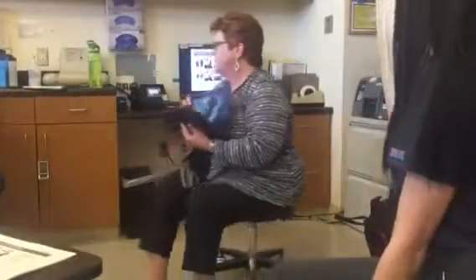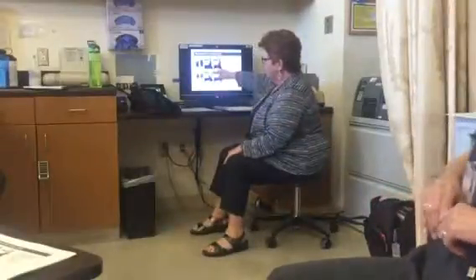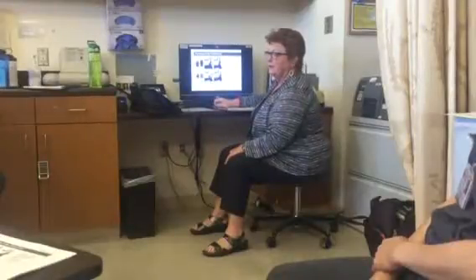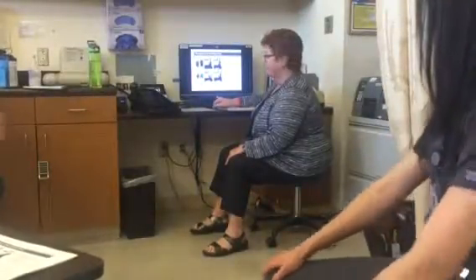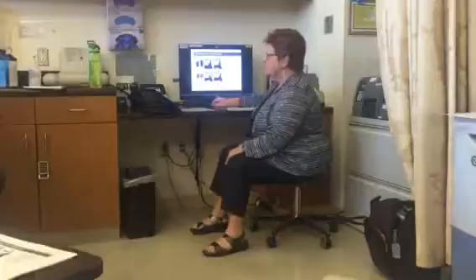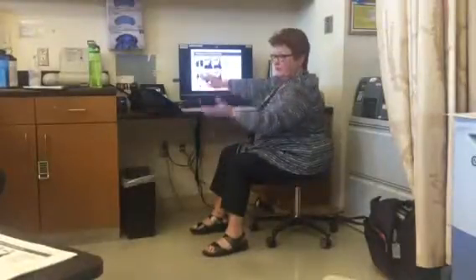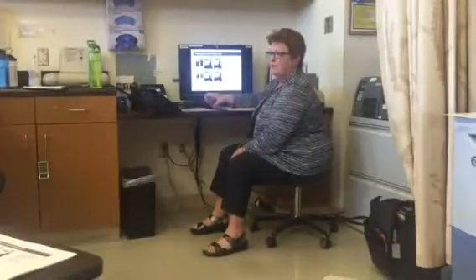And then the other thing that can clump is the collect port. And this looks exactly the same as it does for MNC. Here's your collect port, top and bottom. What's going on here? Anything going through the port? No. So it's probably got a clump. Anything clear, yeah. And on the picture, it was clear as well. No moving picture. And you may see no moving picture. The other thing that you might see are what I call chunky monkeys. The images get real chunky as opposed to free flowing, constantly changing 50 shades of gray.